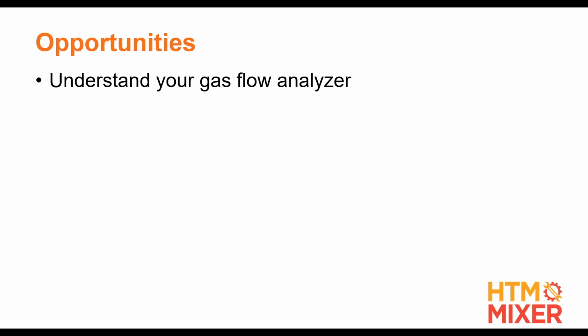For the most part, all the analyzers out there, Flukes, TSIs, IMTs, a few others, they all work. They all measure flows, they all measure pressures, they all do it a little bit different. And so whatever one you happen to have, the best thing that you can do is really get to know that analyzer, know what its features are, and then how to apply them to the ventilators that you're testing.